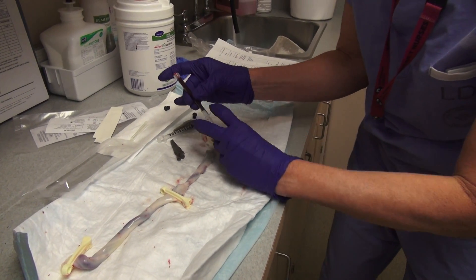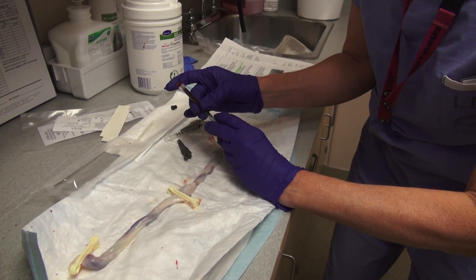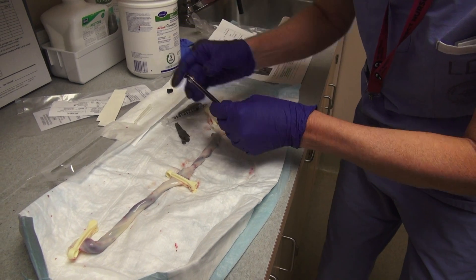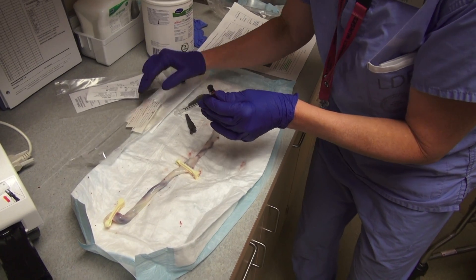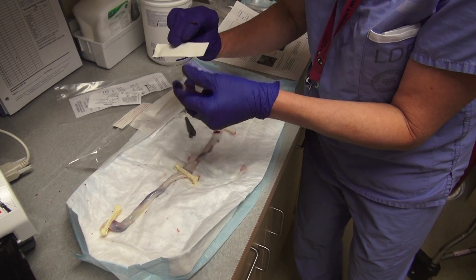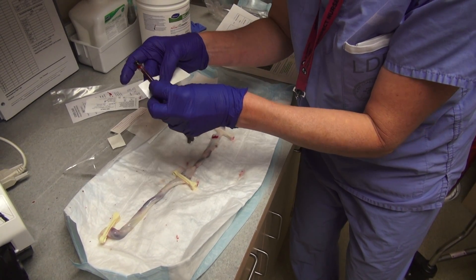You don't want any air in the line, so just make sure you get all the air out — there it goes — and then bring it up just to make sure there's no air, and then put the cap on. Do about 10 rolls just like this. There are two labels — I know this is the venous so I'm going to put the venous label on so I don't get them mixed up. There's my venous sample.